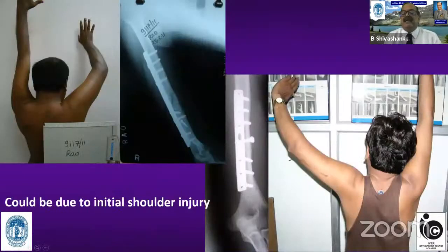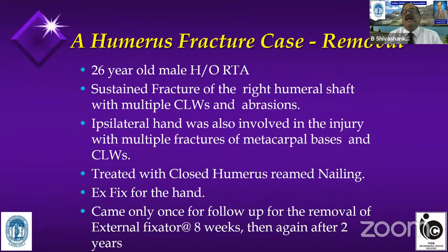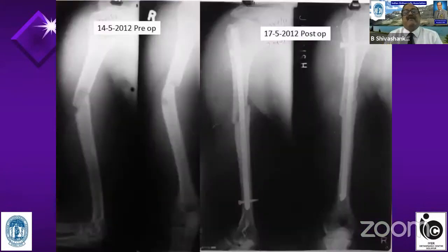Another case of a humerus fracture, plating done. This patient came to me with a shoulder problem, a young adult. I cannot say this is a degenerative cuff tear also. Young adult, it has to be the initial injury. When the bone has to break, it has to have some problem with the joint also. So never blame only nailing for the shoulder stiffness. Friends, removal is also very, very important. Just doing nailing is not enough.